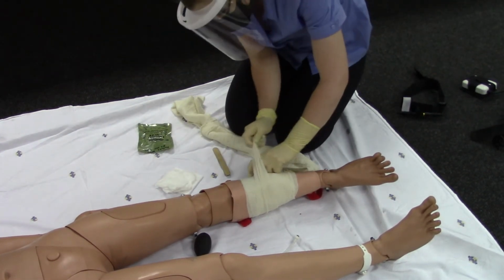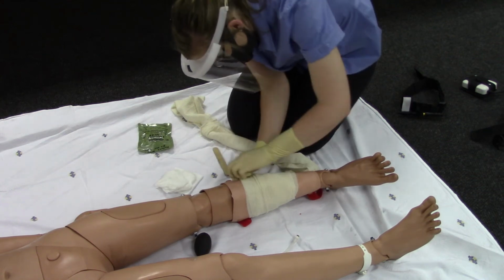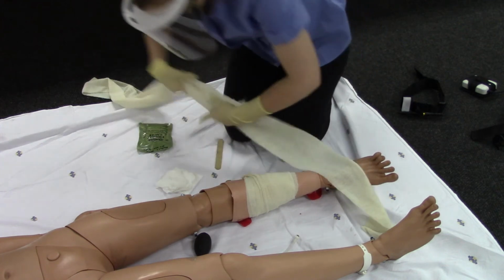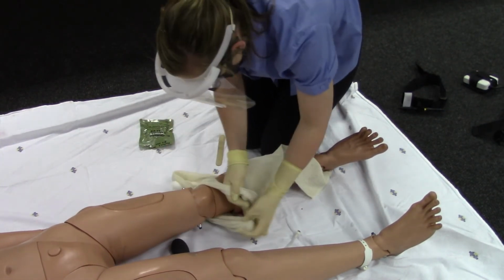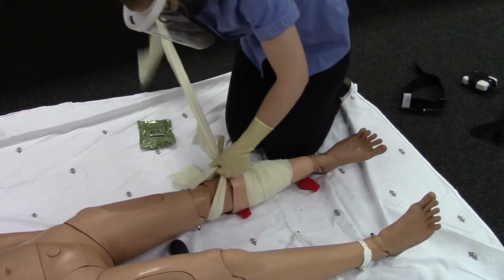Application of an improvised tourniquet. Fold the bandage 10 centimeters above the wound. Tie the ends of the bandage around a stick.